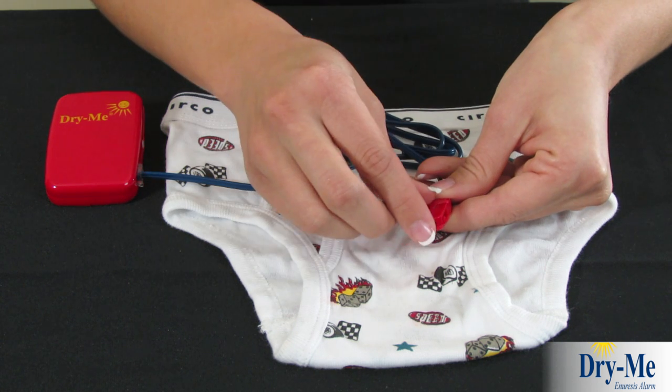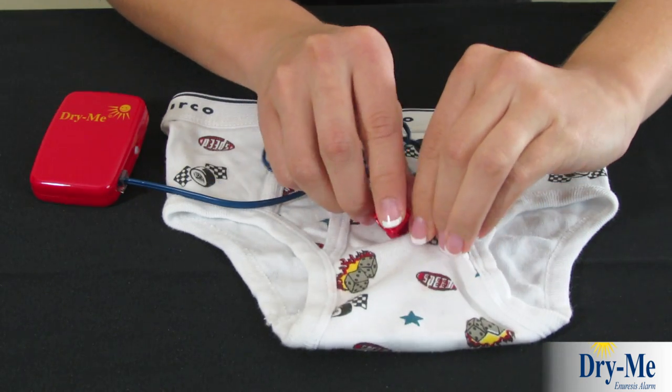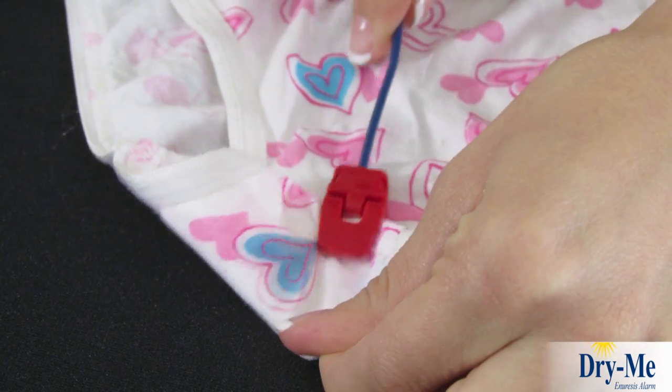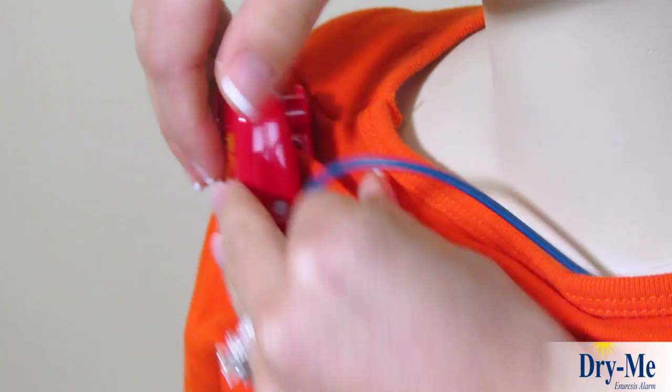The Dry Me is an economical bed-wetting alarm that combines sound and vibration to wake even the deepest sleeper. The moisture sensor attaches to the outside of any close-fitting brief, where you can expect the wetting to first occur. The cord is worn under the shirt and attached to the shoulder with a secure plastic clip.